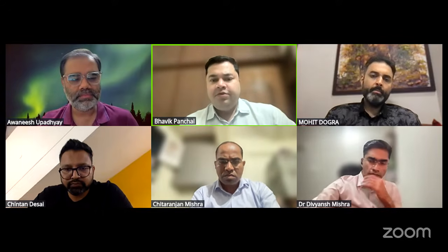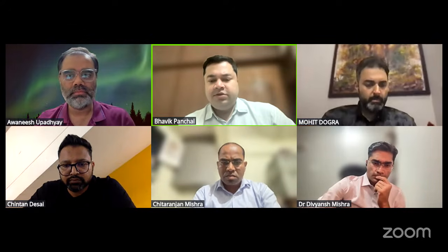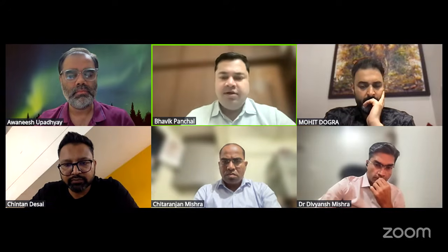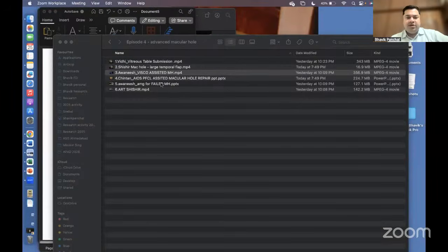Thank you, Dr. Avnish, for that wonderful video and the technique as well. Before we proceed to a discussion on visco-assisted, we'll go ahead with the PFCL-assisted video. For that, I welcome Dr. Chintan, medical director at Rahi Netradam from Dehradun, who is going to speak about PFCL-assisted macular hole closure.